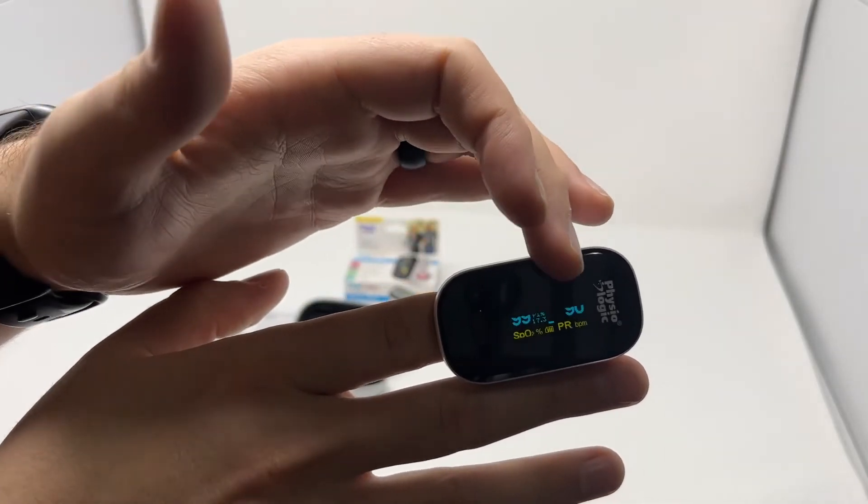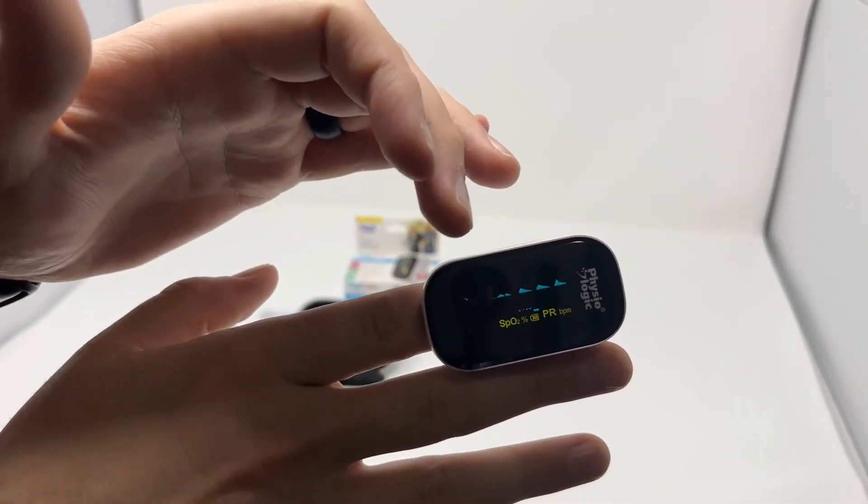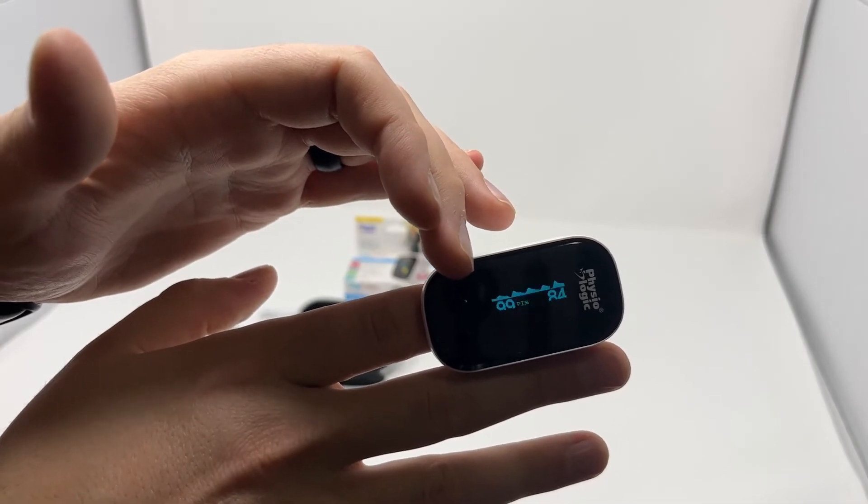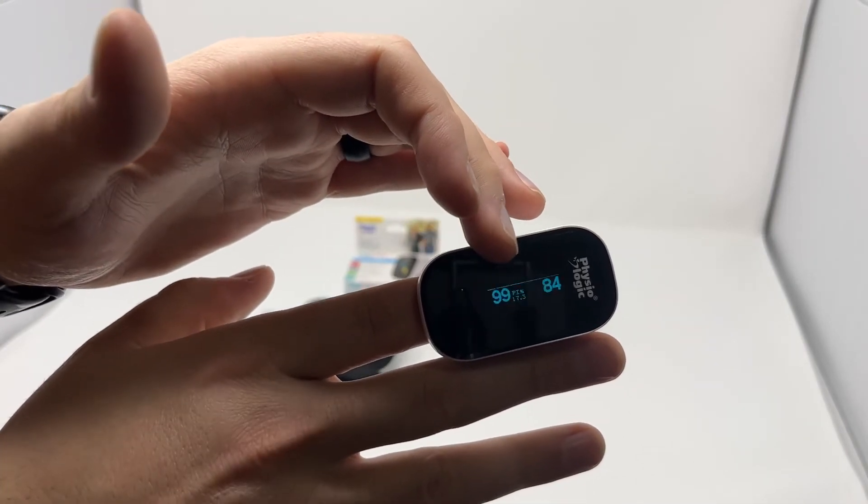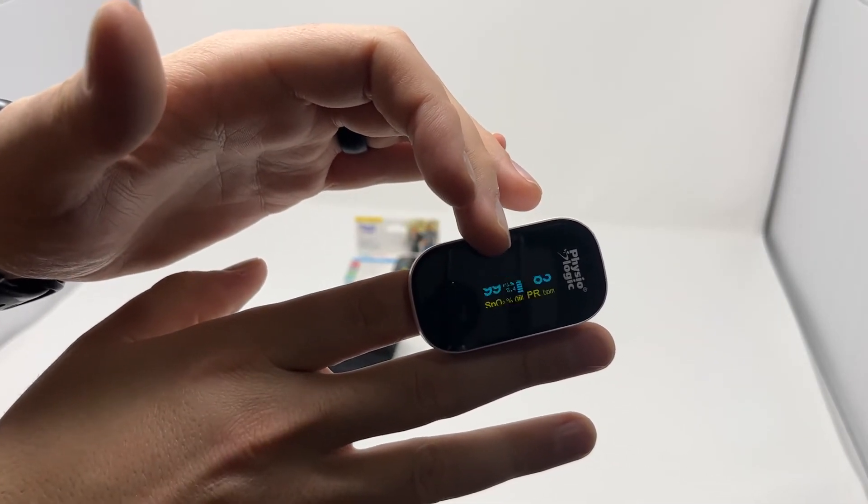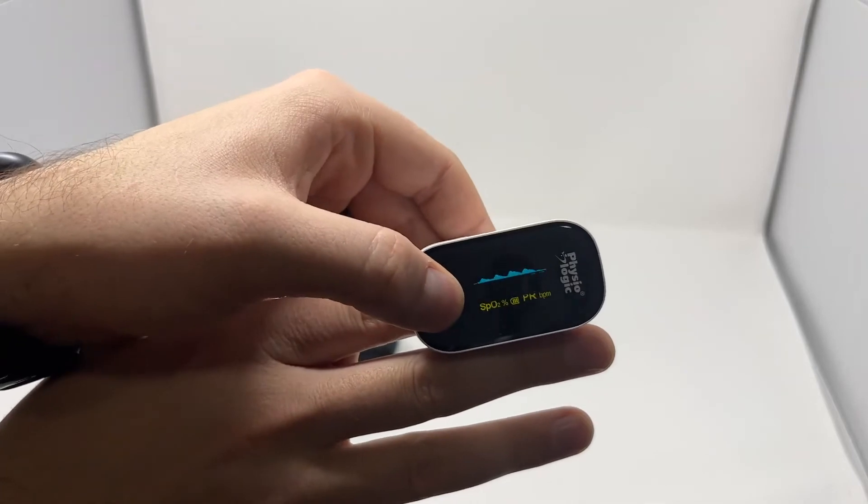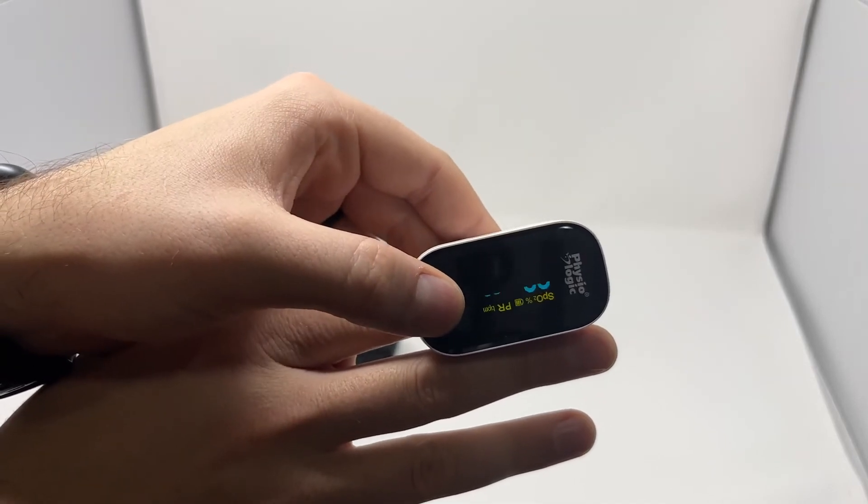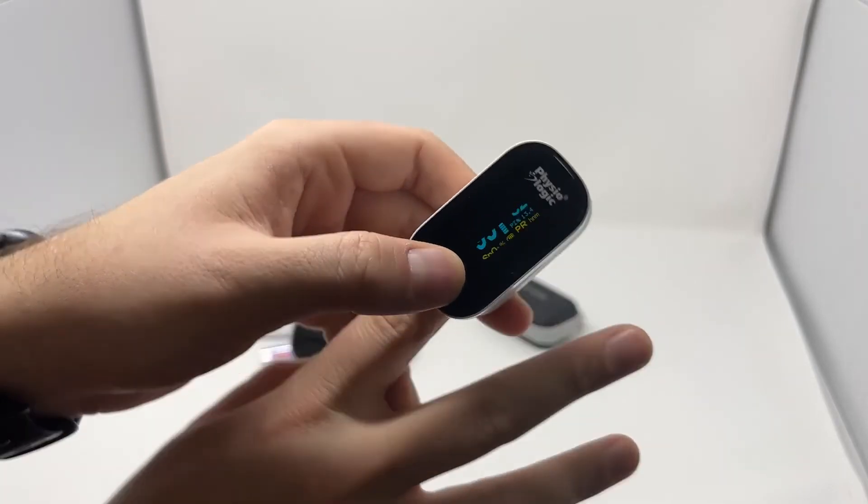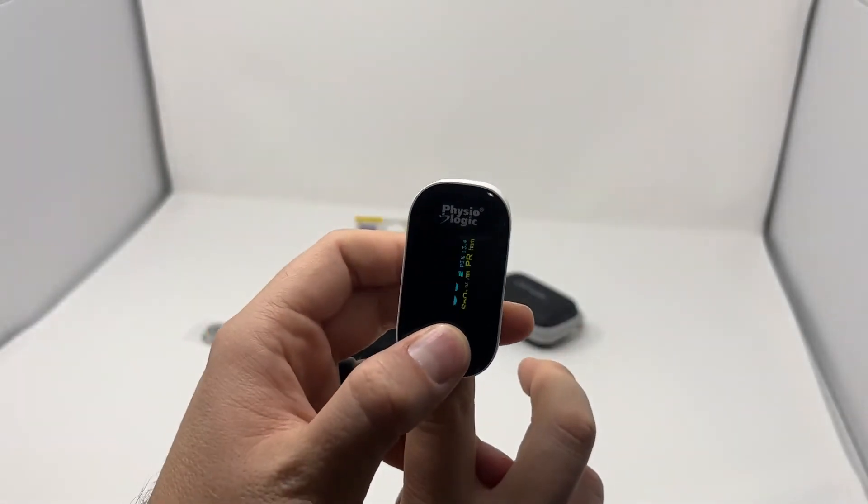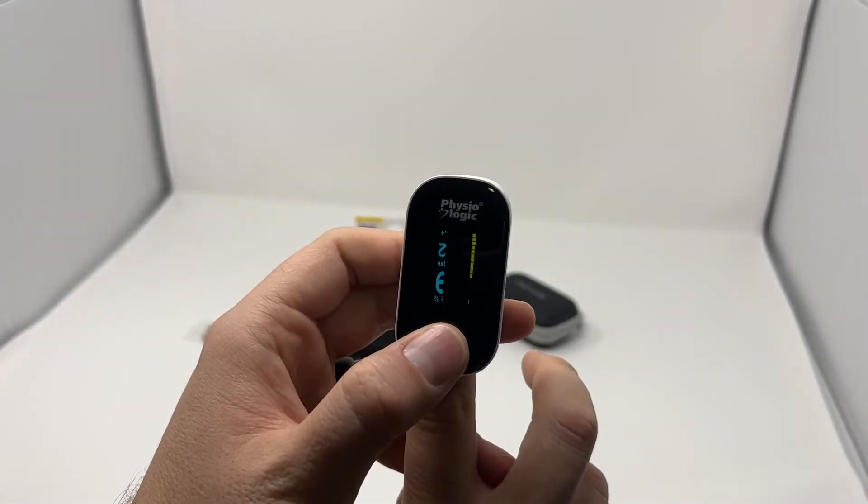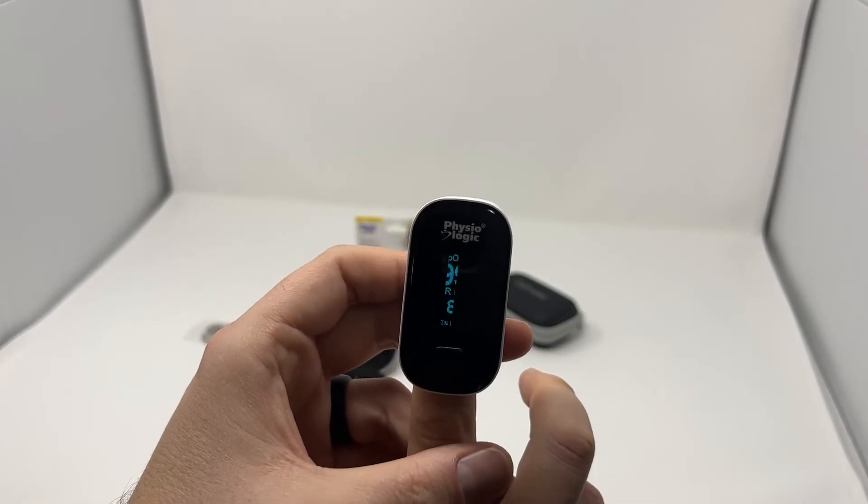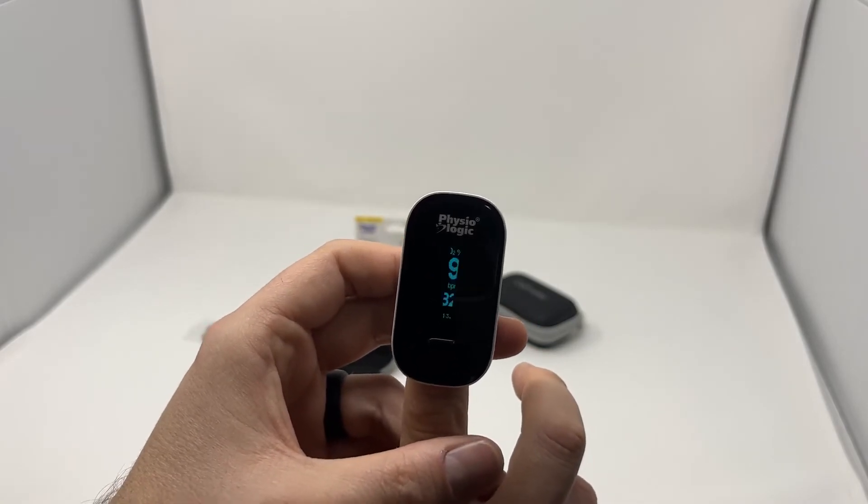You've got pulse right here, you have your percentage of oxygen here, that perfusion index in the middle. And with this button, you can change the orientation of the screen. This can make it easy depending on how you want to read it, just to make those numbers a little bit easier for you.